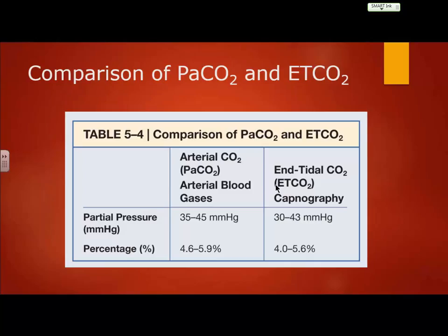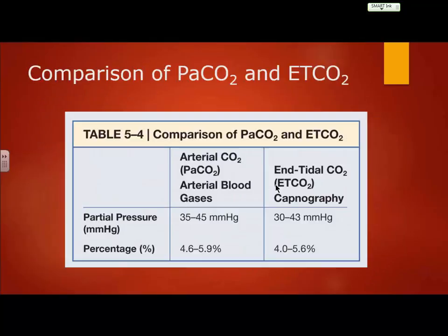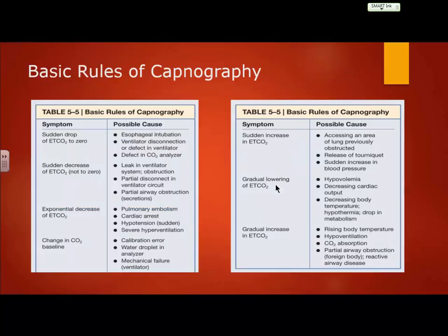Let's wait before I ask that, all right? This is what I was talking about earlier. There's not a huge difference between your arterial PaCO2 and your end-tidal CO2. There's not a huge difference between the two, all right?